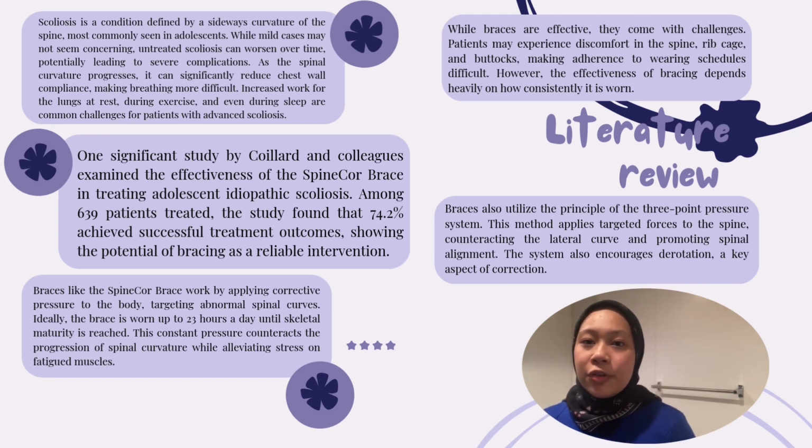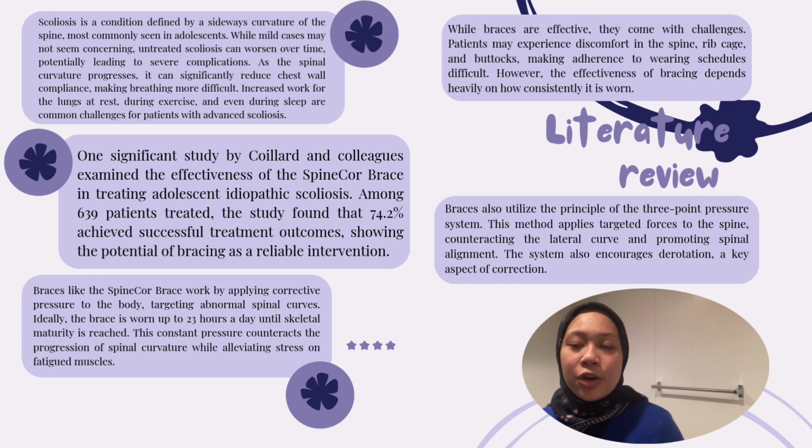Braces also utilize the principle of the three-point pressure system. This method applies targeted forces to the spine, counteracting the lateral curve and promoting spinal alignment. The system also encourages derotation, a key aspect of correction.